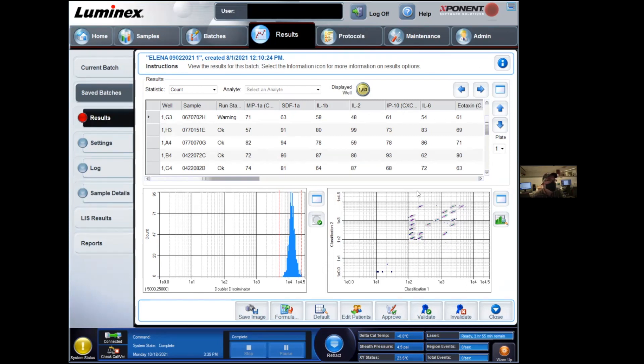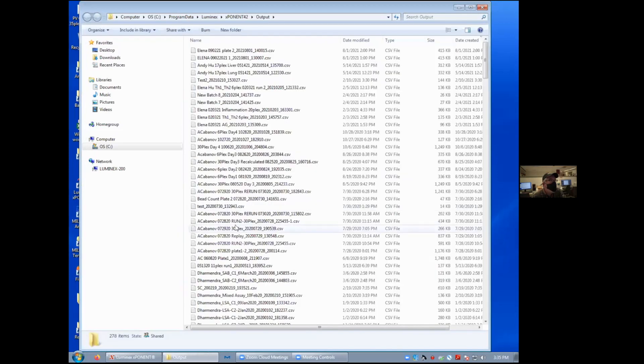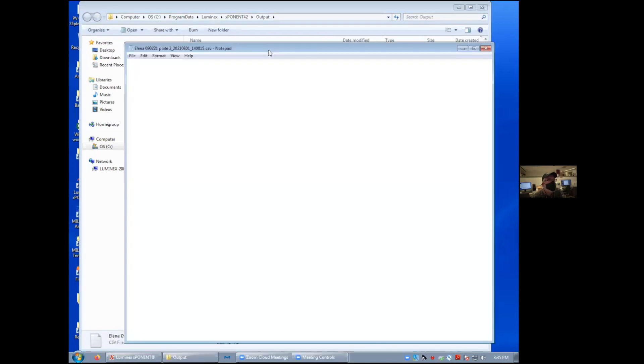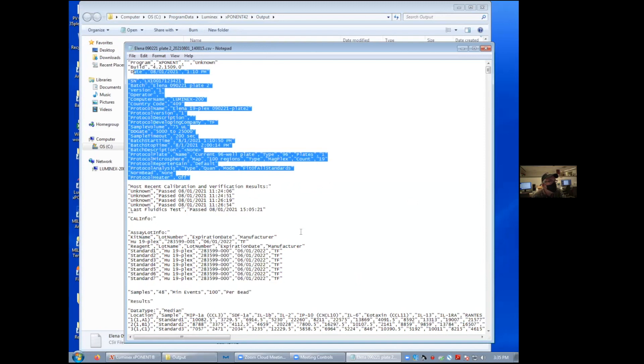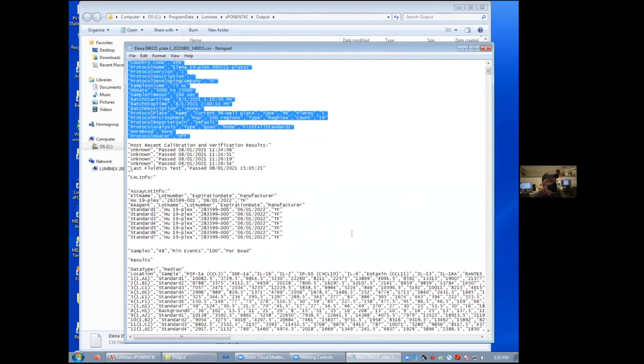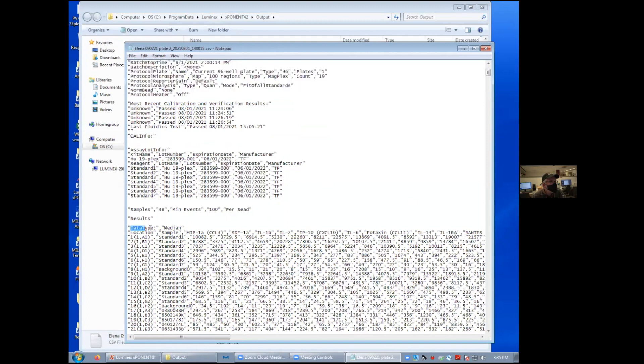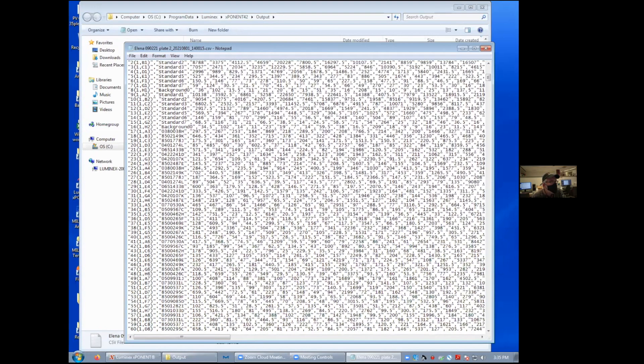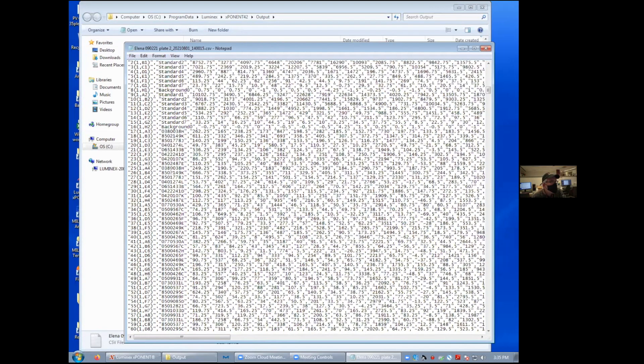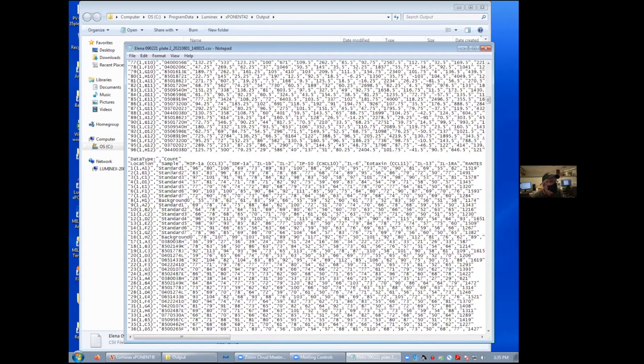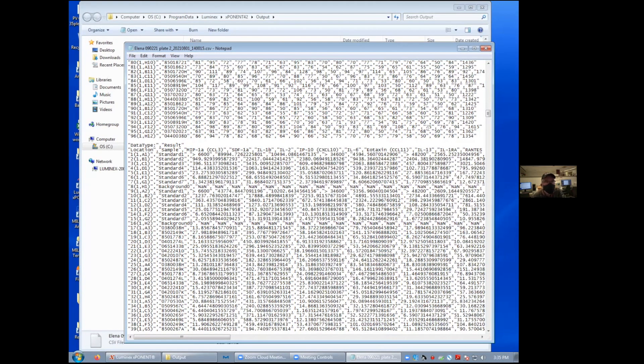At the end of the acquisition, the data is transferred to the desktop in this folder called exponent output. And what you get is, in general, a CSV file that will contain all the information that was measured. And so you have a series of information about the instrument that you use, the name of the operator, all this stuff at the top. And then all these measurements for the median, the net MFI, the counts and all these things have been saved within that CSV file. That's the raw data.